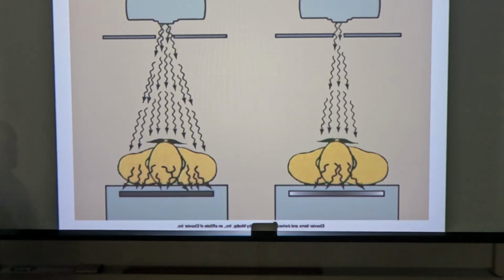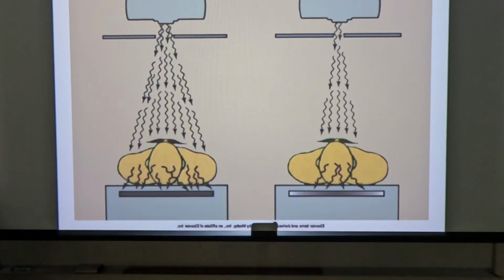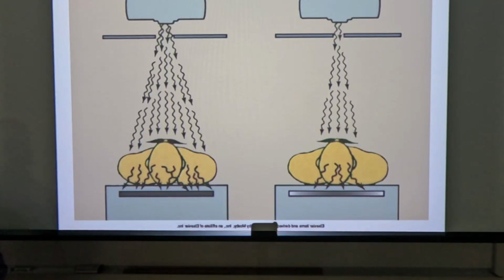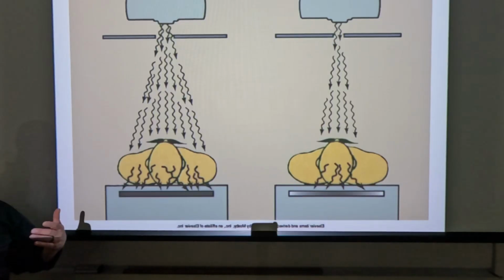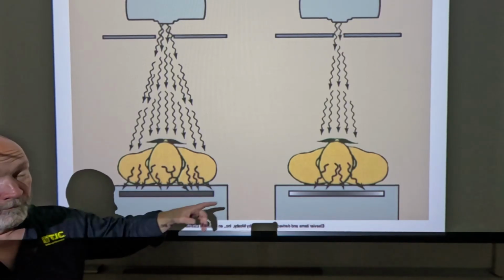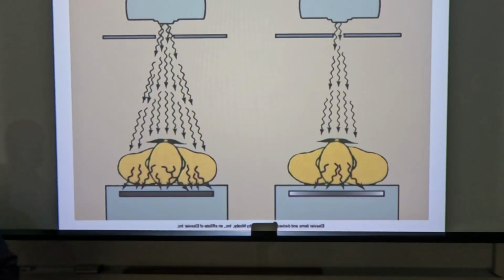So I'm not going to ask you specifics. I'm going to ask you in general. What do you do? Increase collimation, increase mAs, okay, to compensate, to replace those photons. So collimation, from an imaging standpoint, as far as the scatter radiation, cleaning up scatter radiation is probably less important than what it was before, but it's still very important for patient dose, and also it's very important for formulation of your index number.